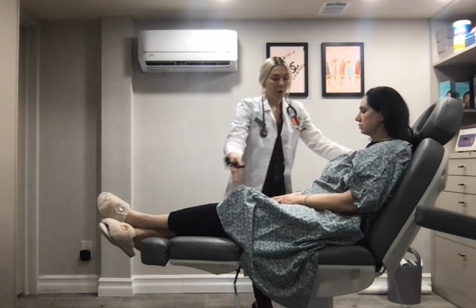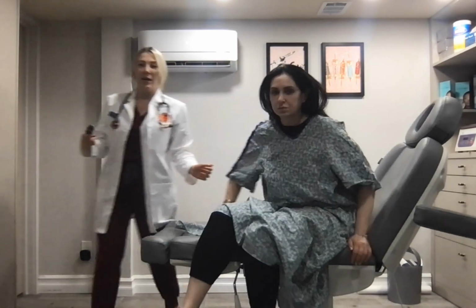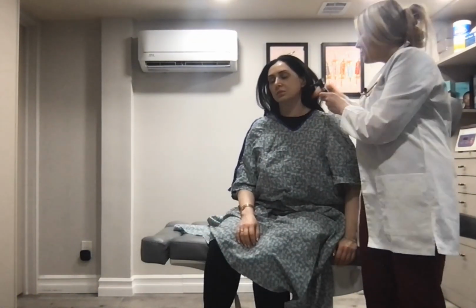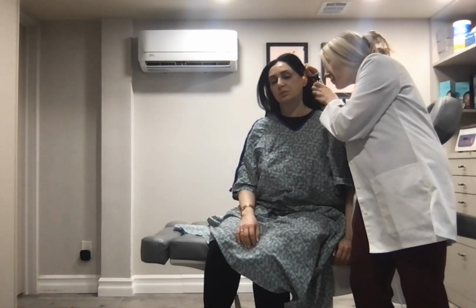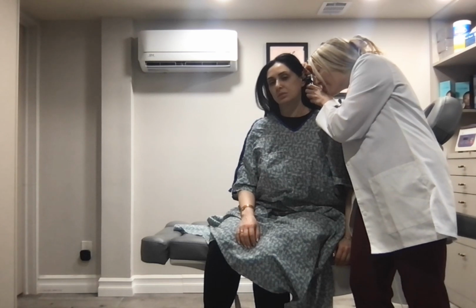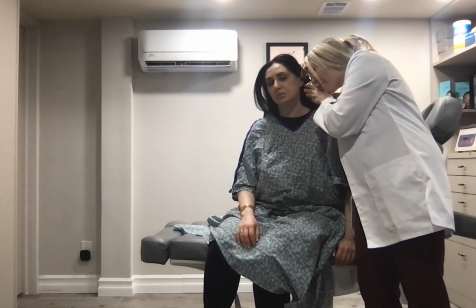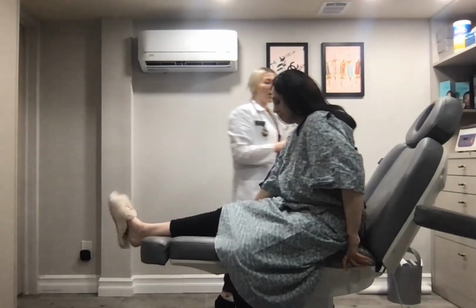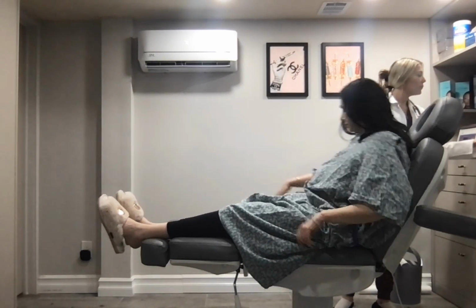I'm going to turn her so you can see that I'm assessing her the same here. Okay, this all looks pearly gray. There's no fluid or any foreign bodies of any kind. Okay, there's no tenderness on the left ear as well.